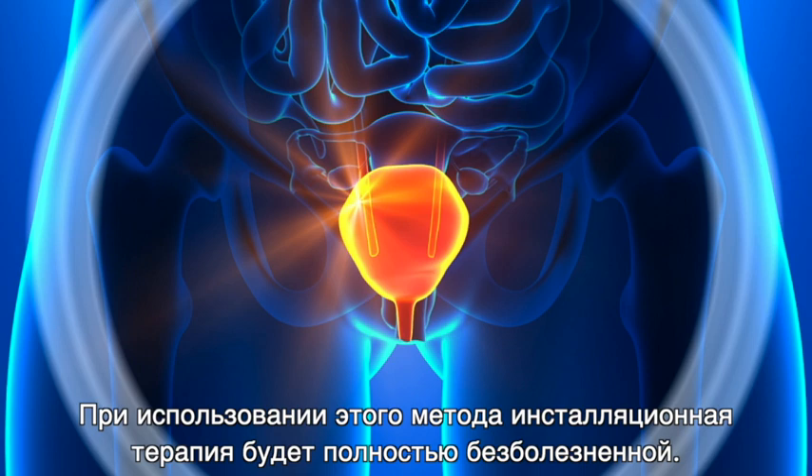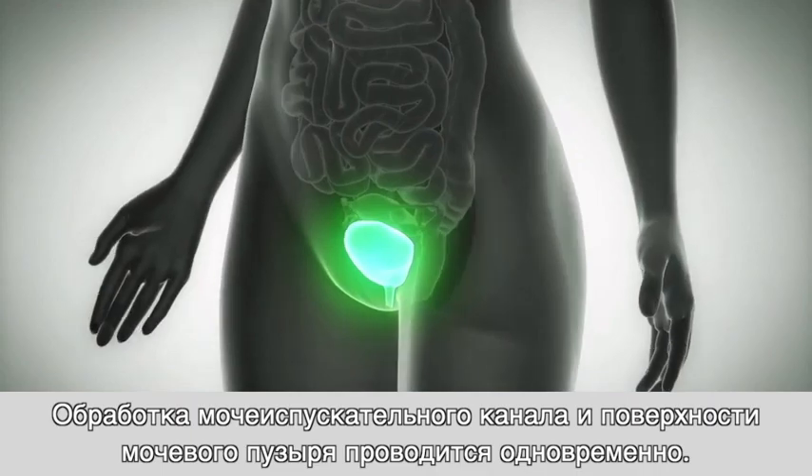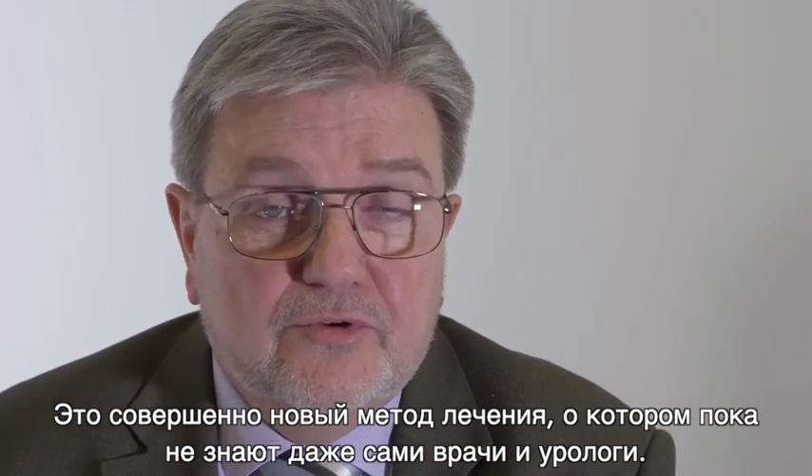By using this method, the instillation therapy will be completely pain-free, and the urethra and the bladder surface will be treated at the same time. This is a new method — even doctors or urologists do not know it yet.